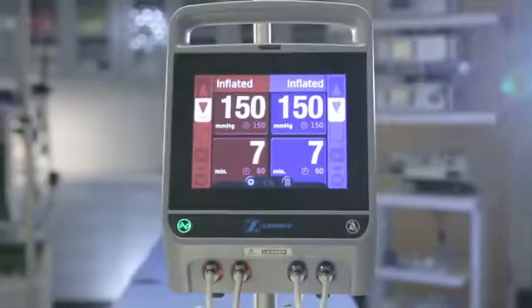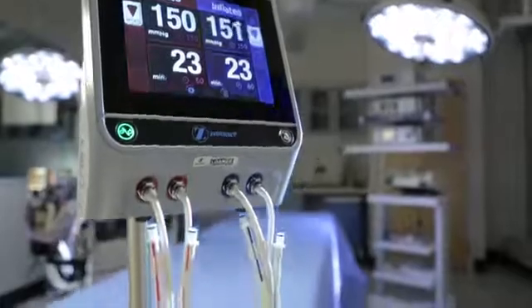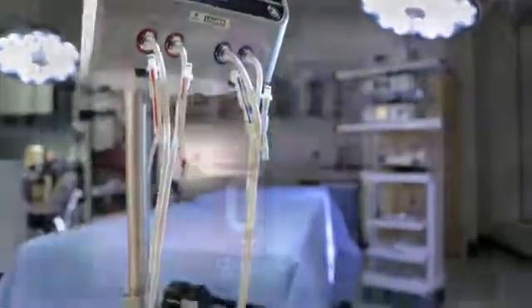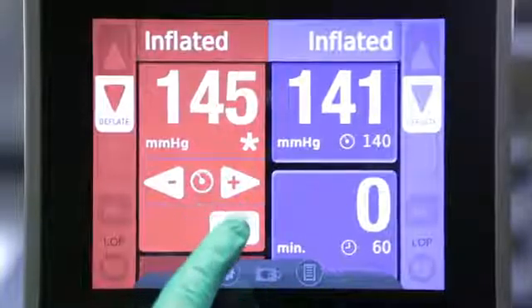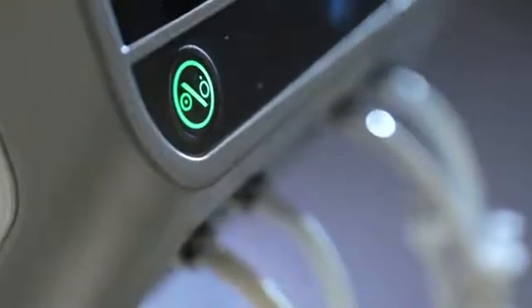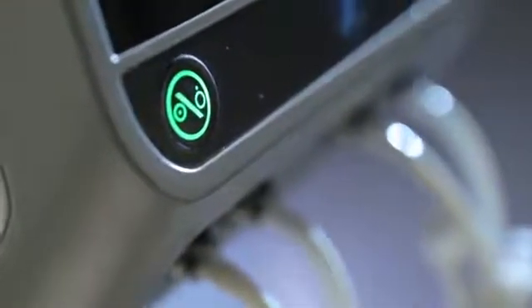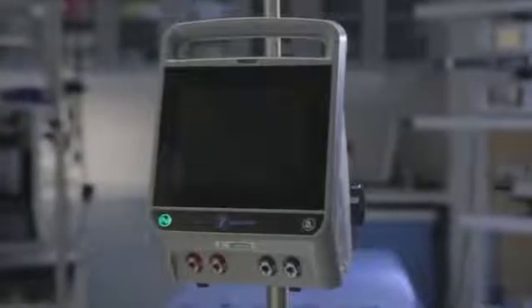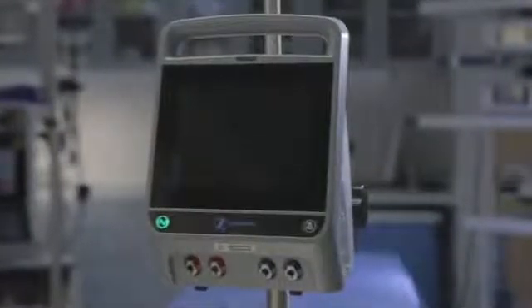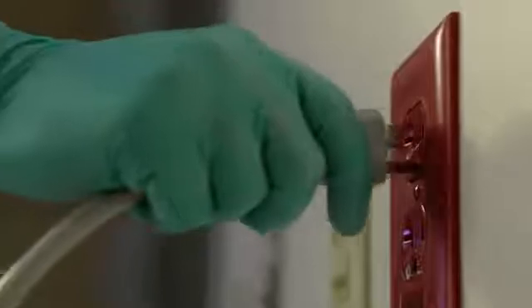The ATS 4000 is designed to take personalization and safety to the next level. It is a dual port, dual cuff system with a large touchscreen display that clearly shows time and pressure during the surgical procedure. The illuminated green AC indicator shows the unit is plugged in and powered by AC. In standby mode, the machine should remain plugged in at all times to keep the battery charged.